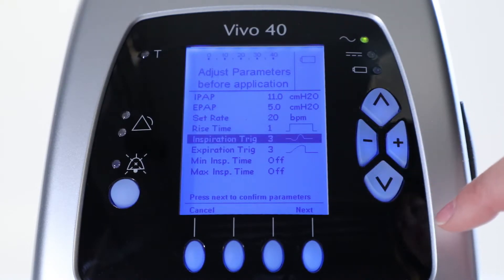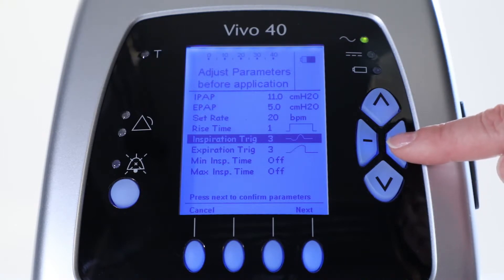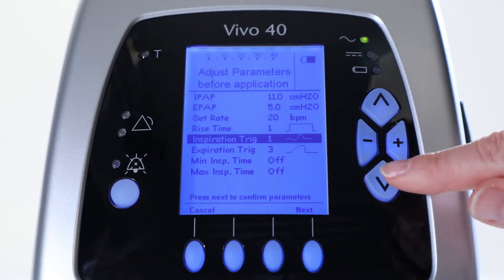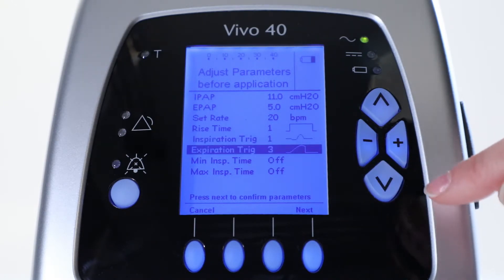Next, you set the Inspiration trigger to allow the patient to trigger a breath. To set the most sensitive, choose 1. Then, select Expiration trigger and adjust it to 3.